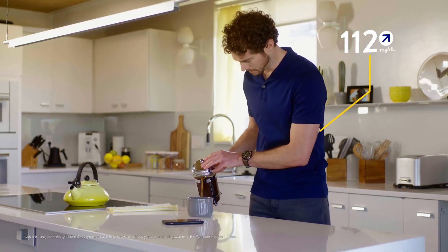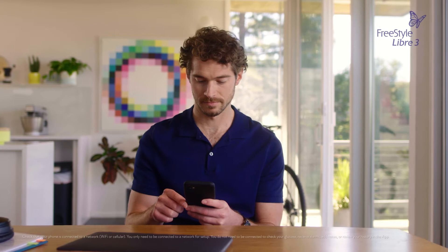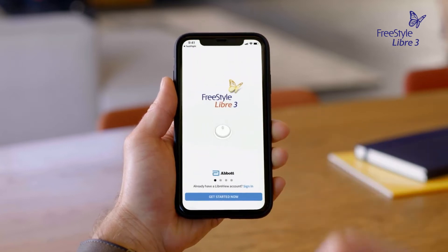Before using the Freestyle Libre 3 app for the first time, it's important to complete the setup, which you can do in a few steps. To get started, download the Freestyle Libre 3 app from the App Store and tap the icon to open it.